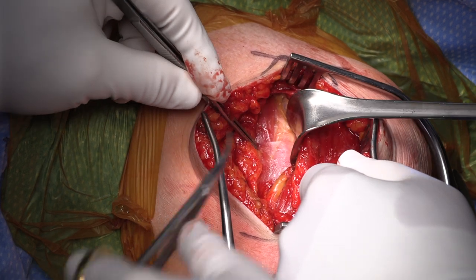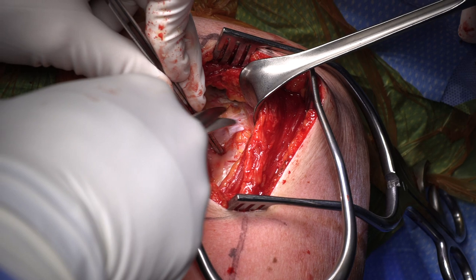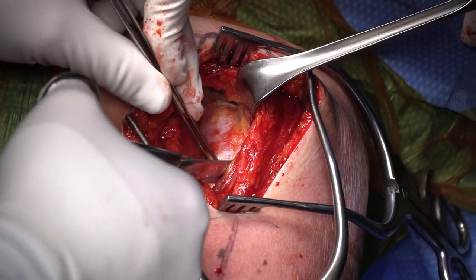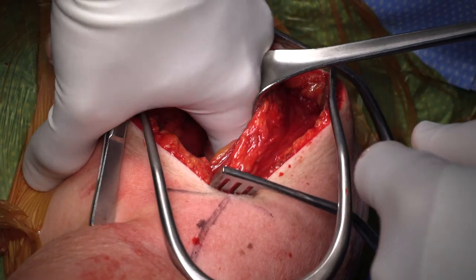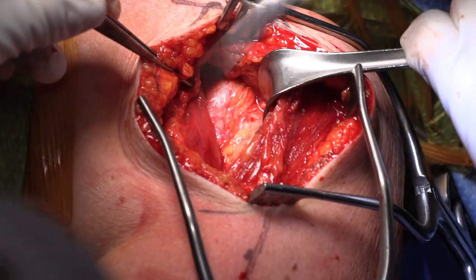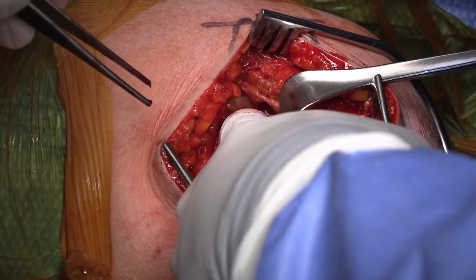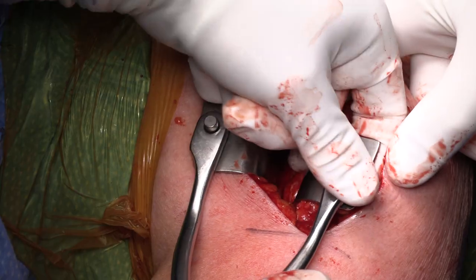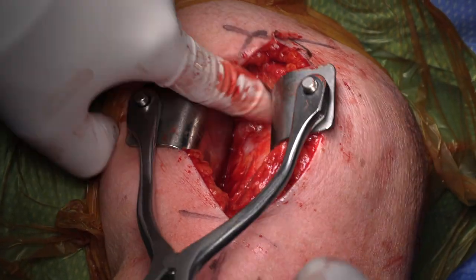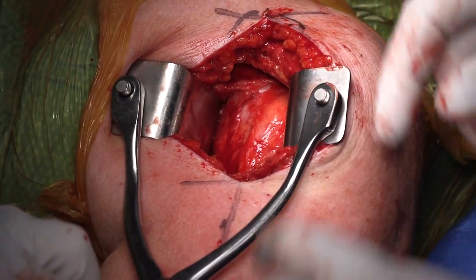The subdeltoid and subacromial spaces are mobilized, providing continuity between the subacromial and subdeltoid spaces. The pectoralis major muscle is mobilized and released as necessary, usually up to 1 cm of its proximal attachment. The clavipectoral fascia is divided longitudinally up to the coracoacromial ligament and the conjoined tendon muscles are mobilized. The self-retaining Colbell retractor is used to retract the deltoid laterally and the pectoralis major and the conjoined tendon medially, exposing the deeper tissues.